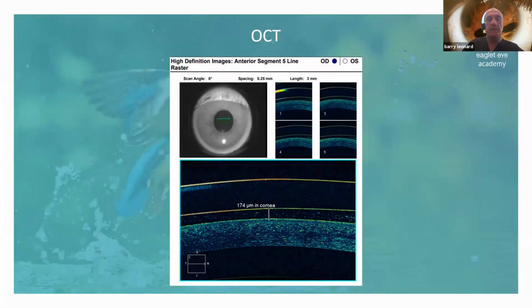This is then the lens on the eye after we dispensed the lens. She came back for her first checkup. Now I like to fit about 200 micron generally clearance. Most of the algorithms are set for about 300 in the Zen lens, and I think in the Boston and others.